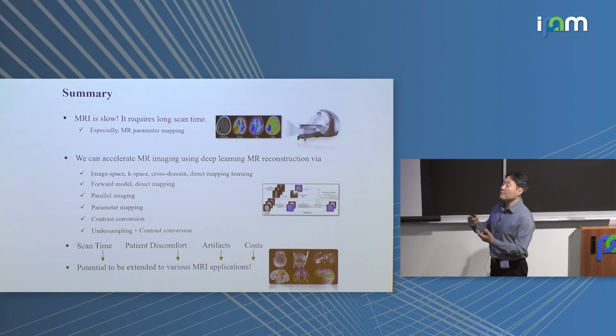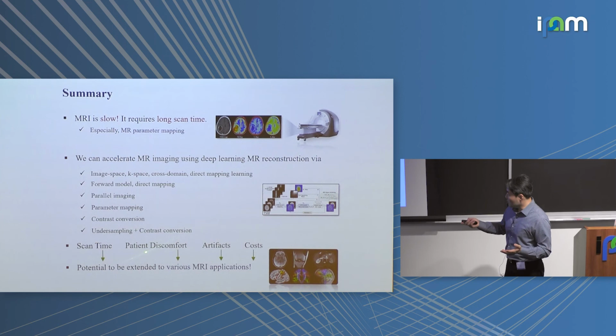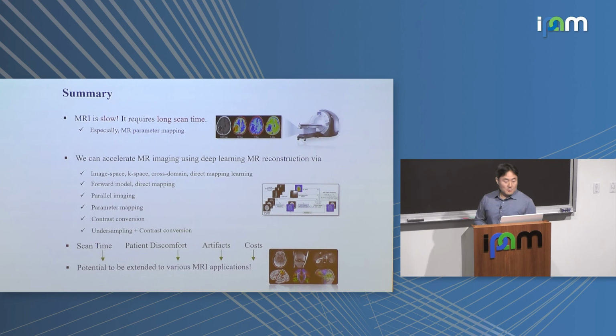Our future work is to combine this undersampling scheme with this contrast conversion to further accelerate MR imaging. So eventually, we can reduce the scan time, and so reduce patient discomfort, artifacts, and cost. And also, these techniques have the potential to be extended to various MRI applications.